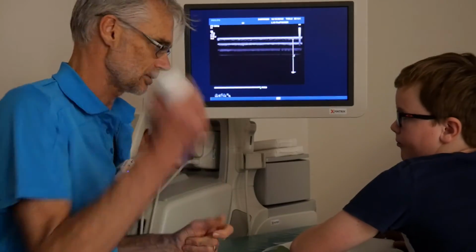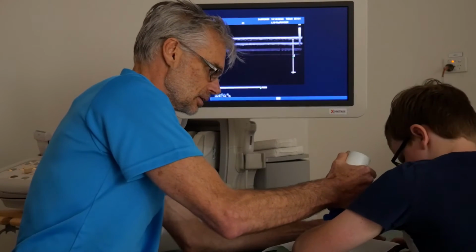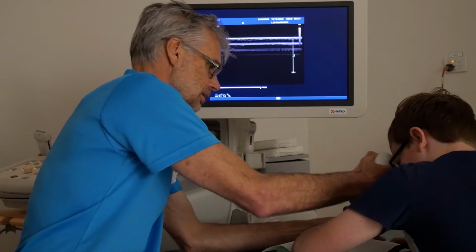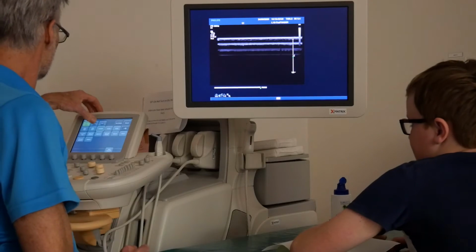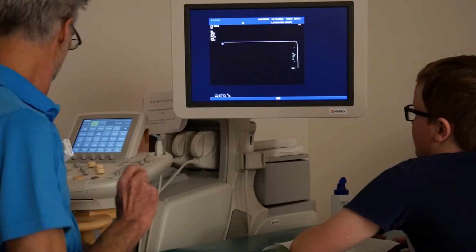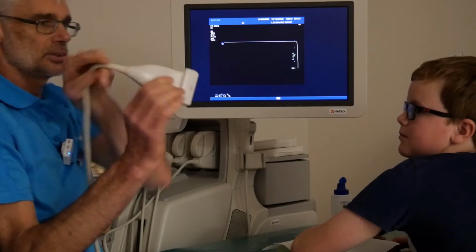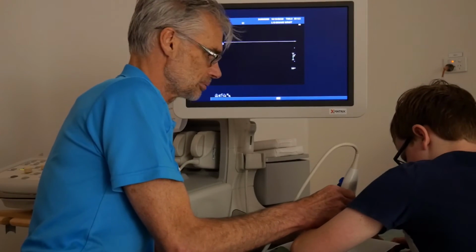So we haven't done this yet, have we? I'm just going to put some gel on here, Hayden. It just goes along your arm like that. Whoops, feels cold. Then we take the probe and we're just going to put the probe on.